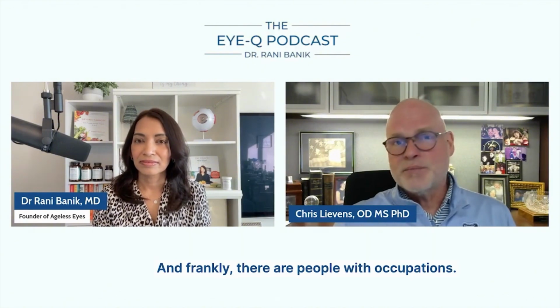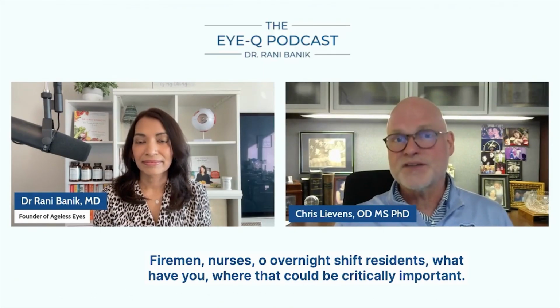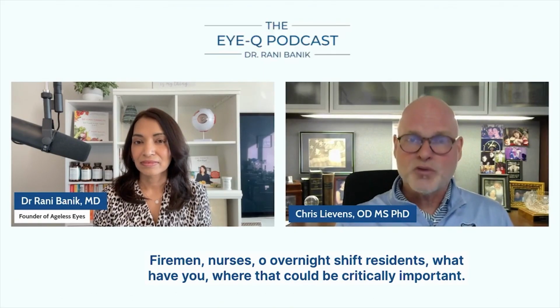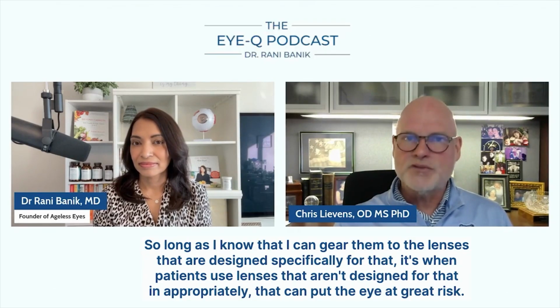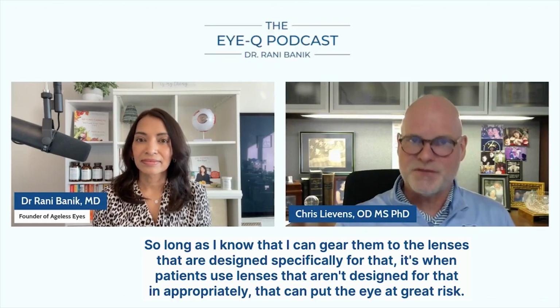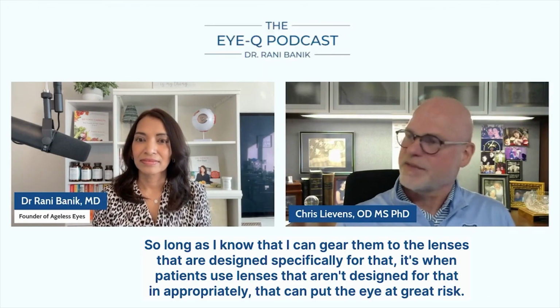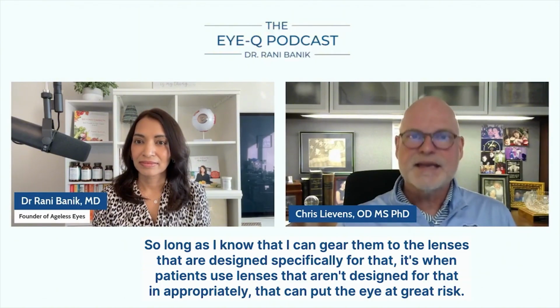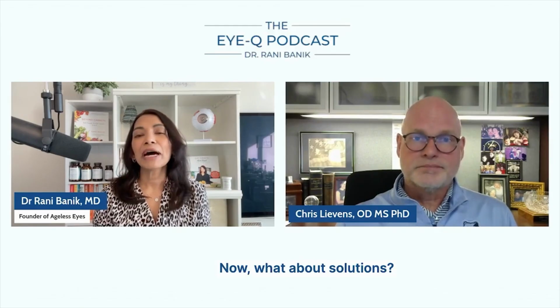And frankly, there are people with occupations, firemen, nurses, overnight shift residents, what have you, where that could be critically important. So long as I know that, I can gear them to the lenses that are designed specifically for that. It's when patients use lenses that aren't designed for that inappropriately that can put the eye at great risk. I see. Now, what about solutions?